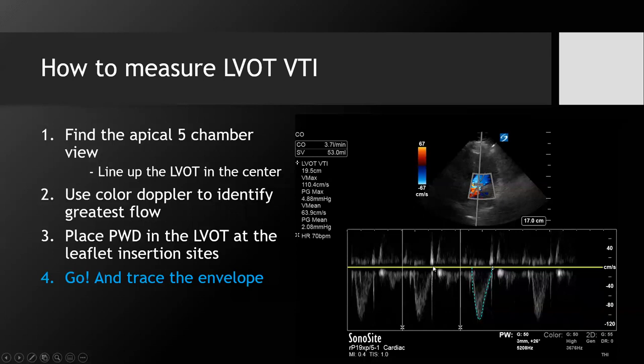This vertical line here is the aortic valve closing, the aortic valve click, and that's normal. You want to see that. And then you have to measure and you trace with the machine. Our machines actually have some AI. They might try to guess, but it's best to do it yourself for now. When you trace, you generally choose the spot where, some of this is maybe turbulent or just flowing around that area before systole.